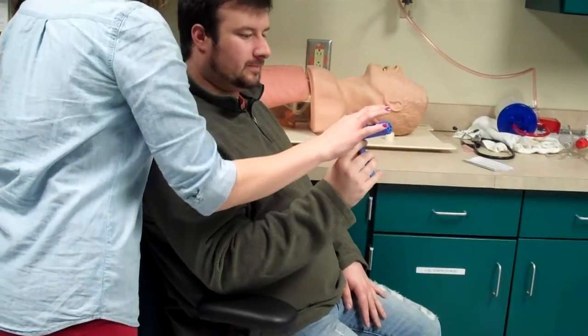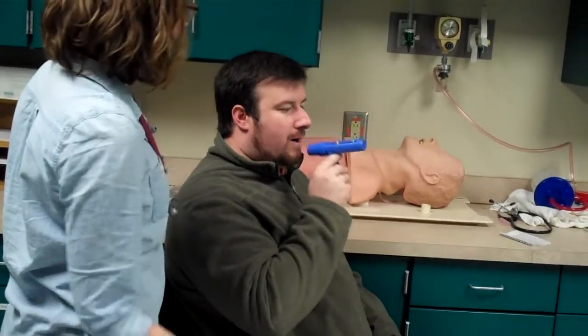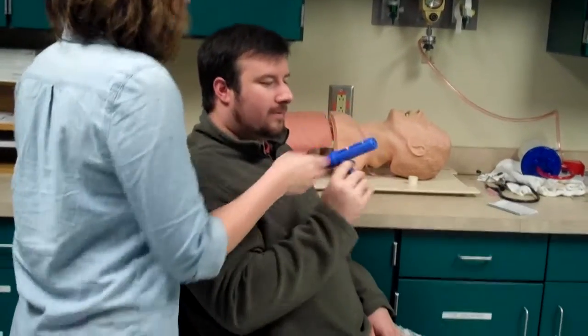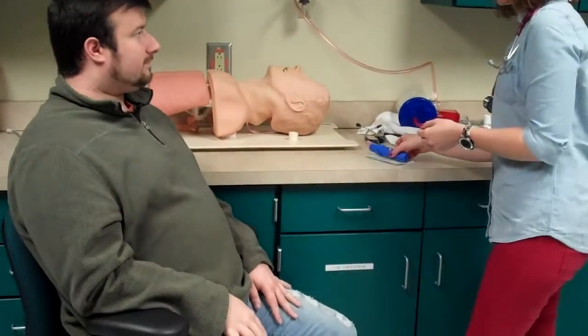That's pretty good. You got 550 on the first try. Let's try it again. Let's see if we can get way up there. Deep breath. Deep, deep, deep, and blow it all out. Good job. 610. Let's try it one more time. See if we really open it. Really deep, really deep. 610 again. Alright. Good job. Yeah, we definitely opened that up a little bit. You feel a little bit better?